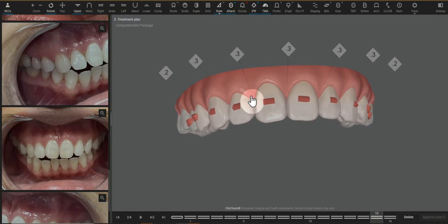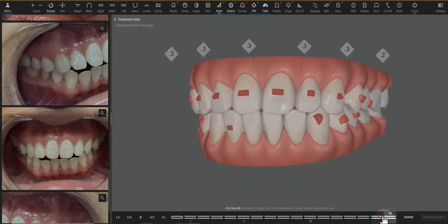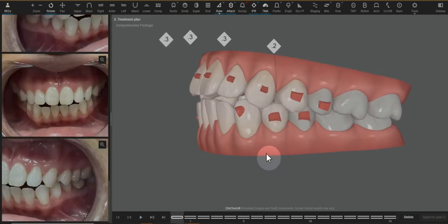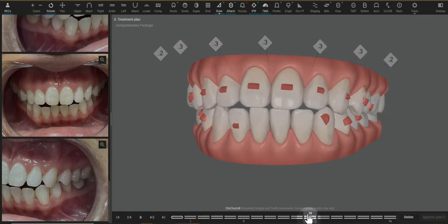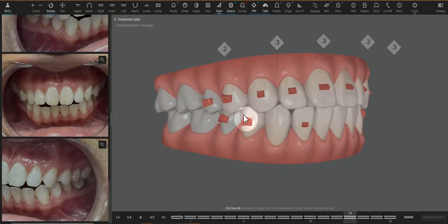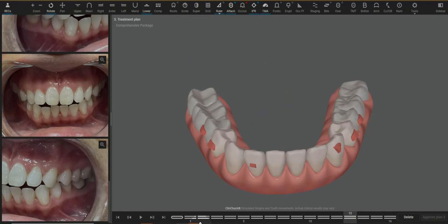These movements are all happening at the same time for the most efficient result. The lower arch looks like these teeth are in a better arch form than the upper. Therefore, there's minimal extrusion needed — we only have the extrusion attachment on this single lateral incisor. But we still want to make sure all movements on the lower anterior are happening most predictably by still maintaining these retention attachments.